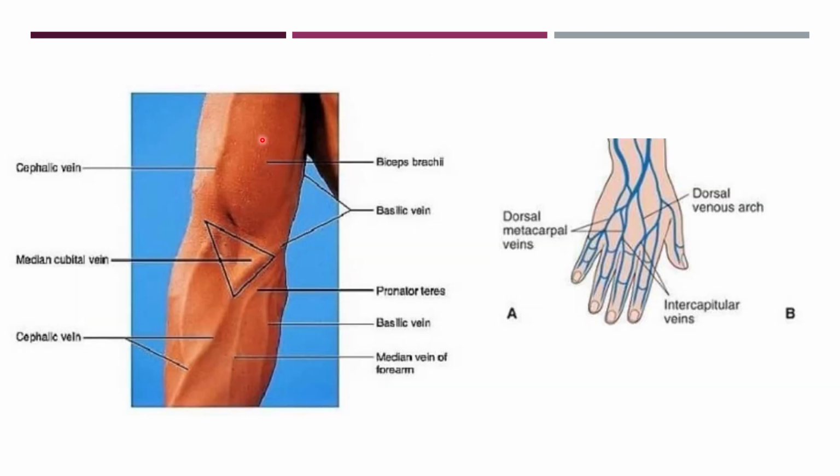Now this figure shows the different kinds of veins present at the antecubital fossa. The first vein is the cephalic vein, the second is the basilic vein, and the third is the median cubital vein. You can collect a blood sample from any of these veins, but you should make sure that the blood will flow out easily.